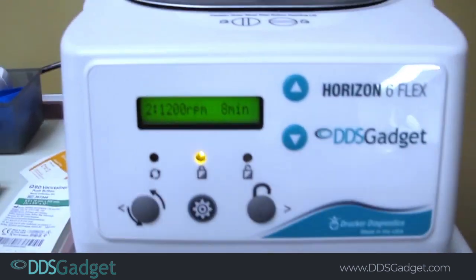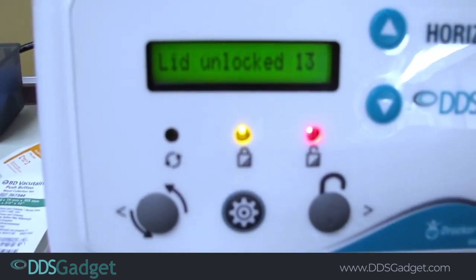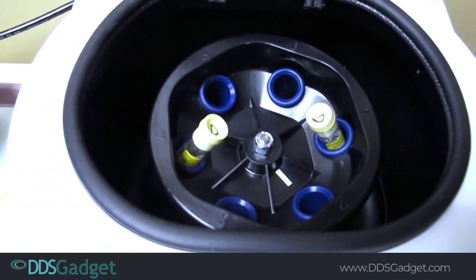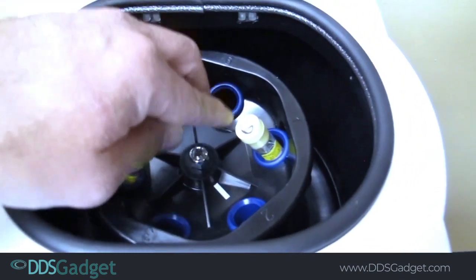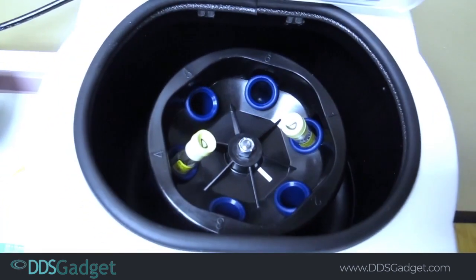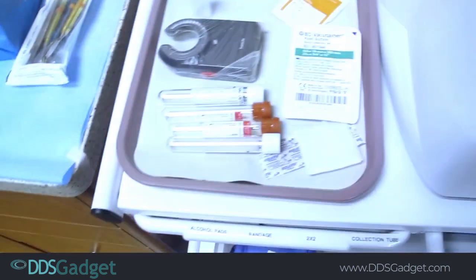Here's how we unlock the button — we push the unlock button and it counts down, and we grab it and twist to unlock it. I have two dummy tubes in here; these are just empty water-filled tubes to balance it. We are going to draw two IPRF tubes and two APRF tubes.